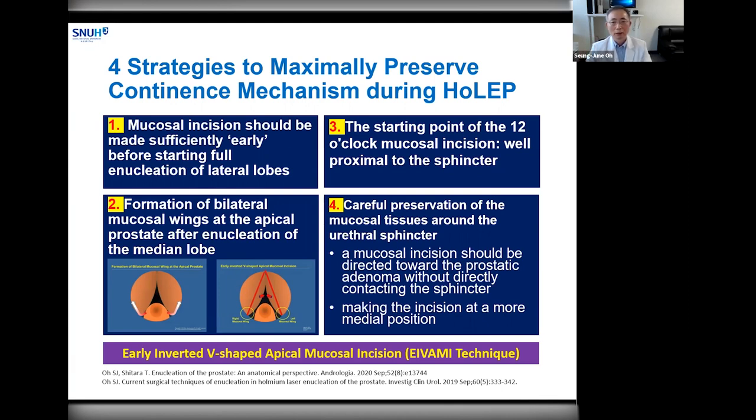Third, the starting point of the 12 o'clock inverted V-shaped mucosal incision should be way proximal to the sphincter so that you can avoid direct sphincter damage at the apex in the 12 o'clock position. This point is very important, and I will show you using my surgical video later. Fourth, careful preservation of mucosal tissue around the urinary sphincter — never make any mucosal incision against the circular sphincter tissue; instead, make an incision at a more medial position over the prostatic adenoma. Collectively, my surgical technique is described as the early bilateral apical mucosal incision, or EBAMI, technique.